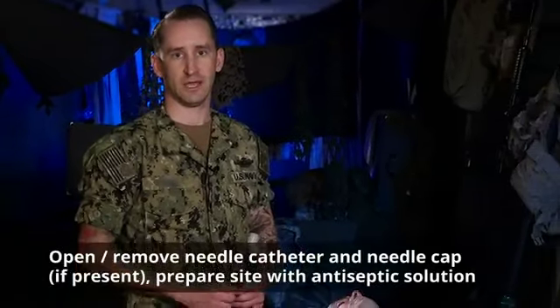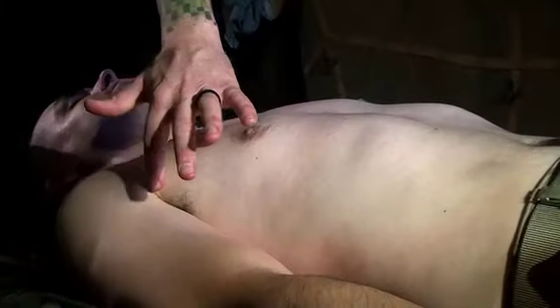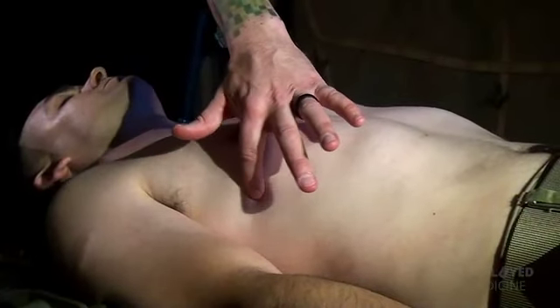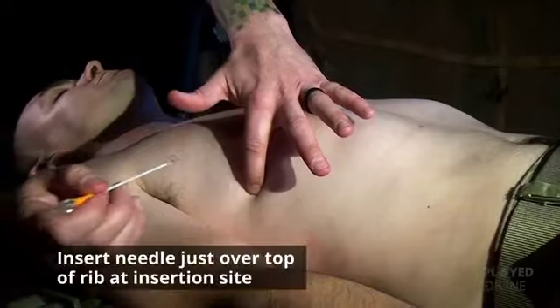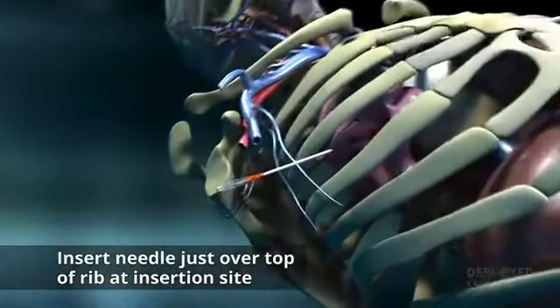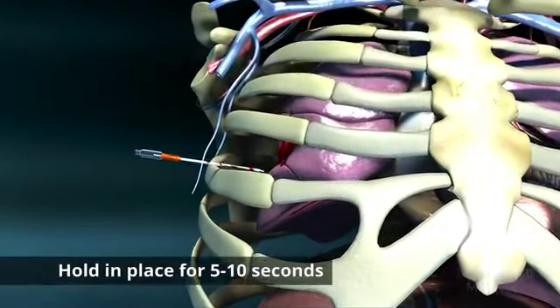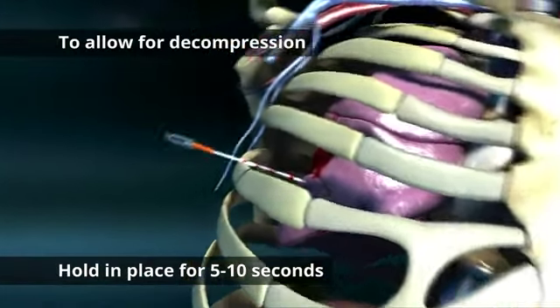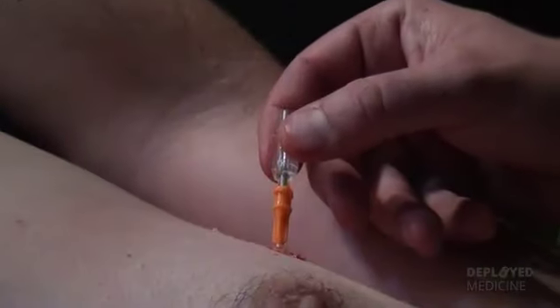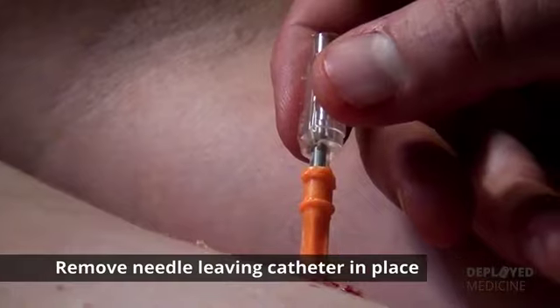Once you've identified the site, take your 10 or 14 gauge 3 1/4 inch needle catheter and begin your insertion. Following the anterior axillary line, I'm going to insert my needle just over the top of the lower rib at the insertion site. Insert the needle catheter unit all the way to the hub and hold it in place for 5 to 10 seconds to allow decompression to occur. After the NDC has been performed, then remove the needle, leaving the catheter in place.